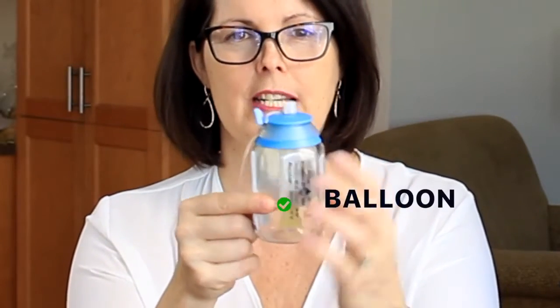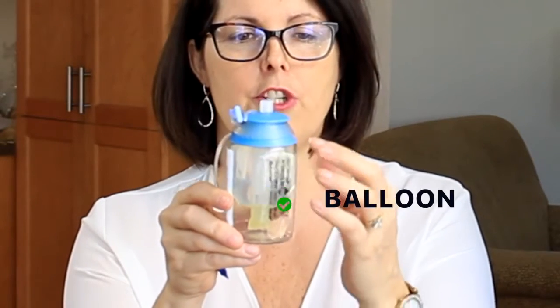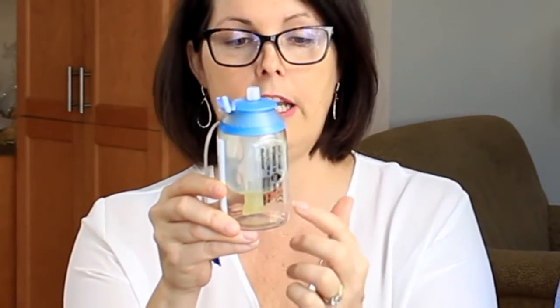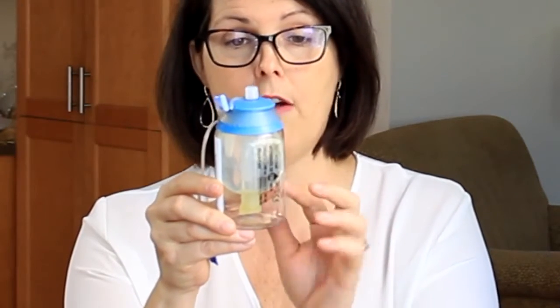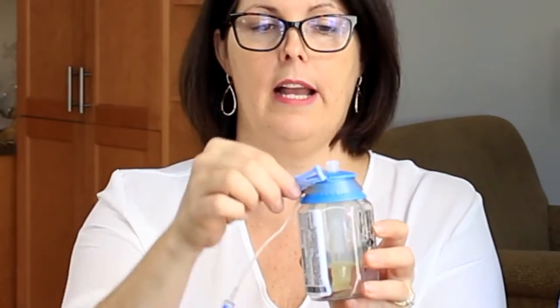So the medicine is in this balloon, which is inside this plastic housing. When you're looking at the bottle, you want to make sure that it's clear, that there's no fluid leaking either inside the bottle or on the outside. You want to make sure that there's the cap on the end of the tubing, and then there's also a slide clamp on the tubing, and then this little cap on the very top of the bottle.